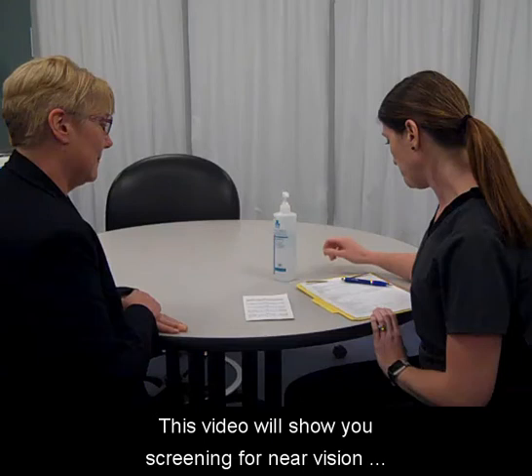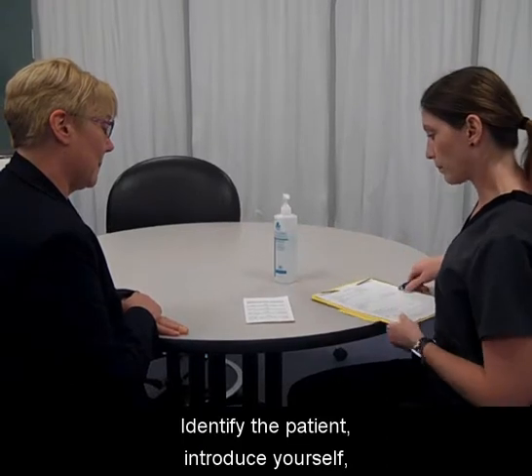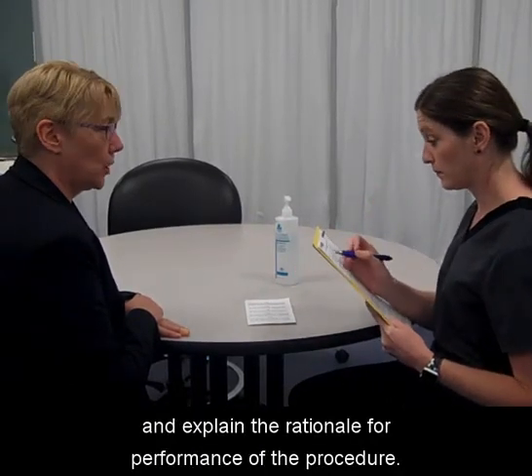This video will show you screening for near vision acuity using the Jaeger system. Identify the patient, introduce yourself, and explain the rationale for performance of the procedure.